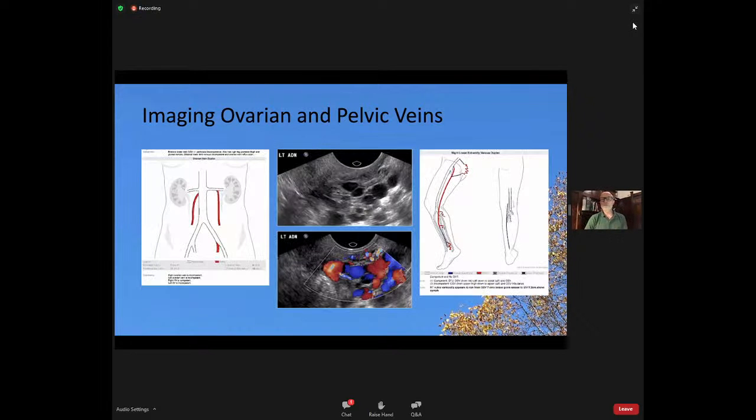And so I put this up because I think our sonographers are getting much better at identifying venous incompetence, both in the ovarian and pelvic veins. And so we get these really nice, documented, dilated, incompetent veins that we can make good decisions on. So I would say a lot of our practice has gone towards vascular sonographers identifying this, rather than going for CT or MR.